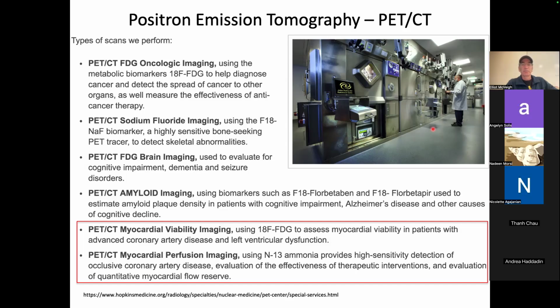And so you have the particle accelerator, it makes those atoms, and then you have this really expensive part, which is this radiopharmaceutical chemist person, right? Who knows how to mix all of these radionuclides into organic molecules and things like that, such that you can inject it into the patient.